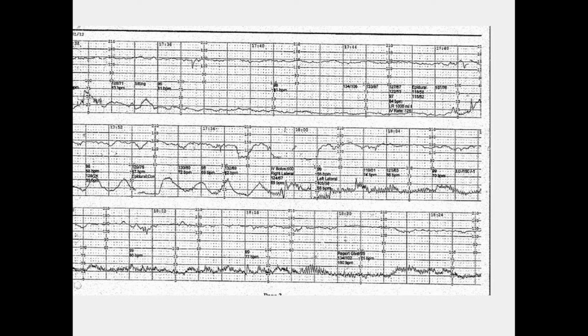What is the variability here? It's hard to see because it's little. Yeah. Does it look like it has the normal wiggle in it to you, right? So you guys don't even really need to think about those definitions so much. I mean, when you're taking your course, you need to know those numbers. But it looks like it's minimal variability overall.